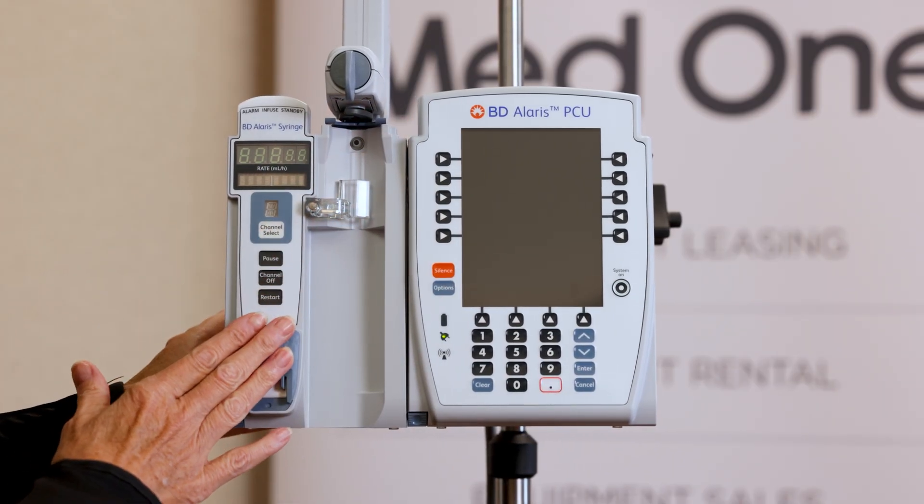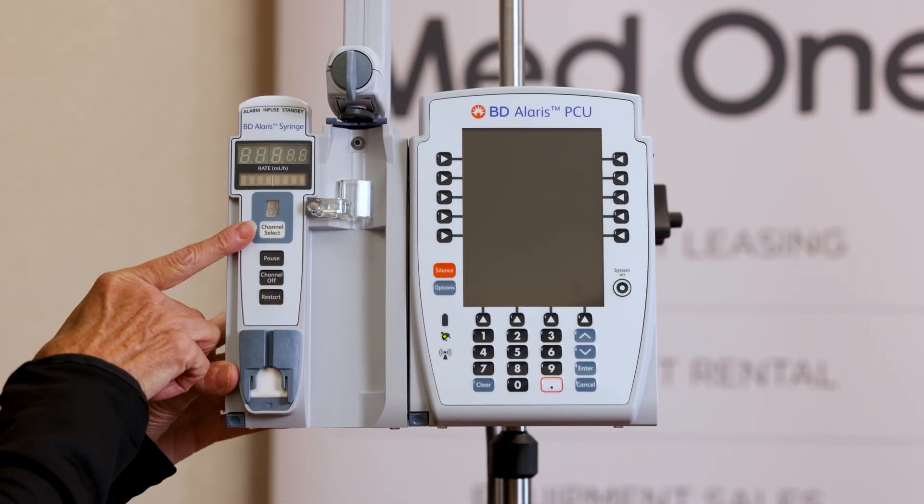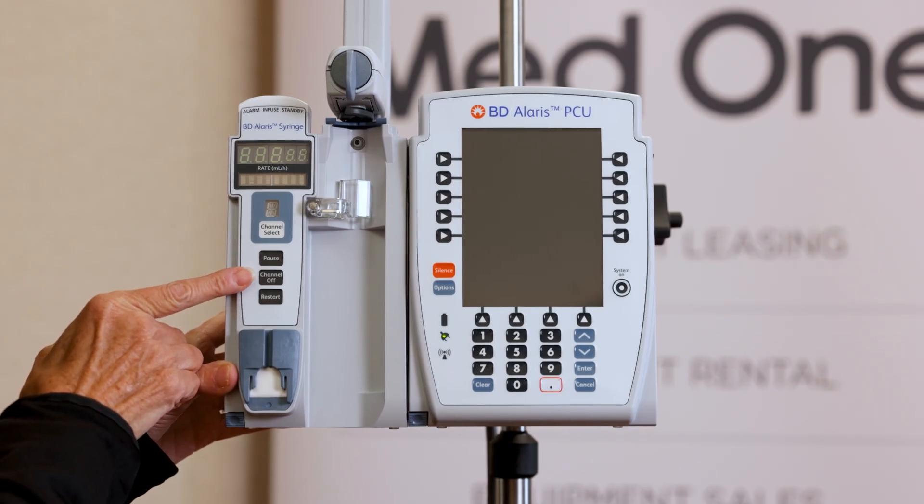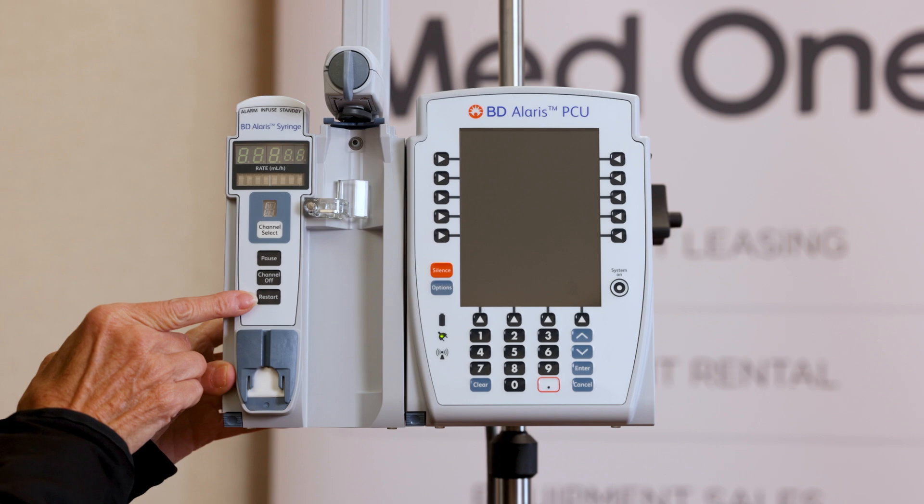Moving over to the syringe pump, it has your channel select button, pause, channel off button — which is how you will power everything down — and restart.